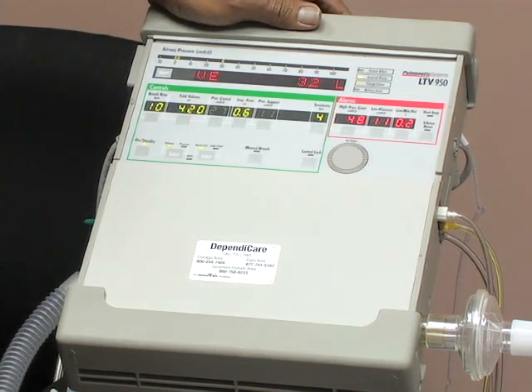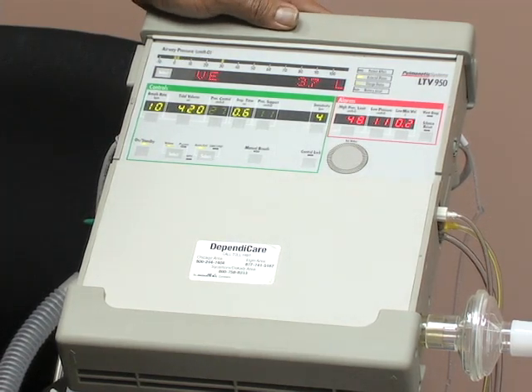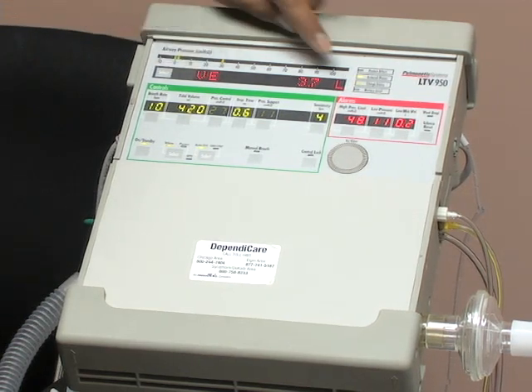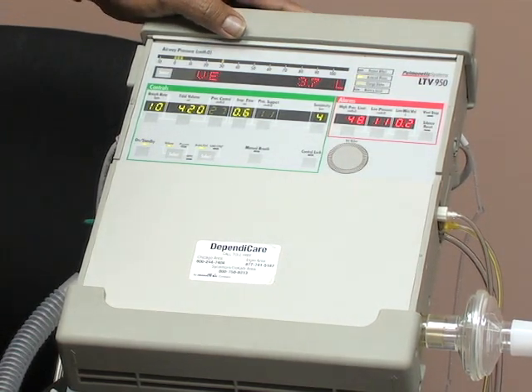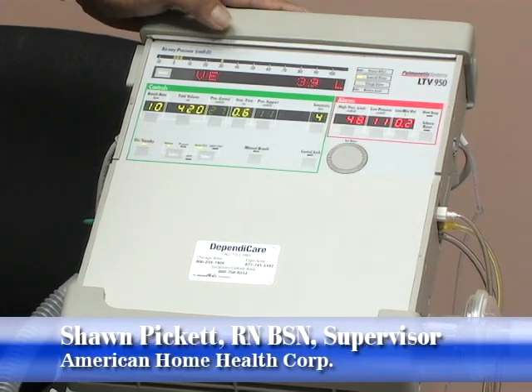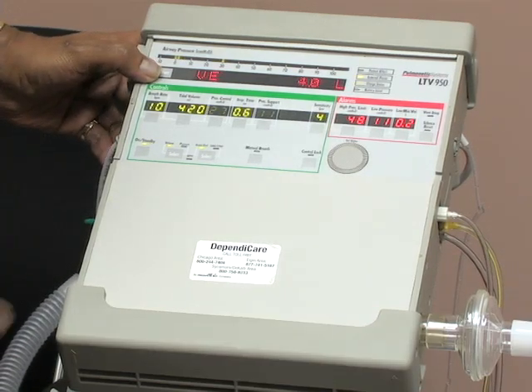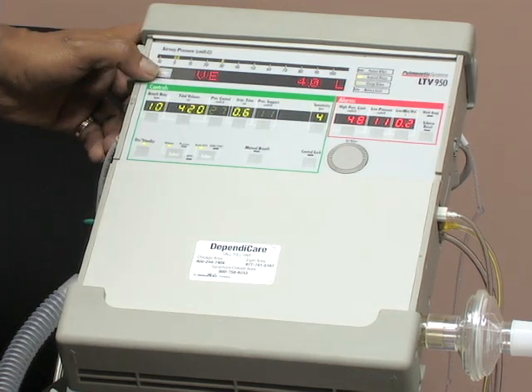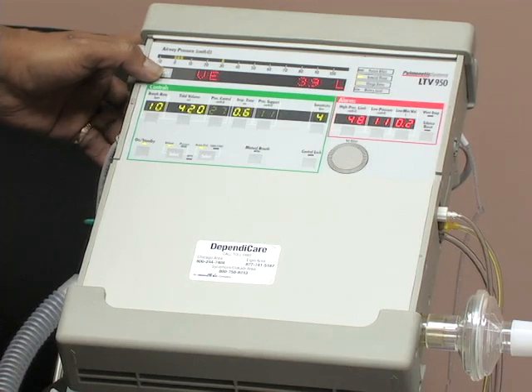Let's look at your VE. This is your minute volume. It's also an expiratory volume, but your VE is a measurement in liters versus milliliters of how much your client has expired over the last 60 seconds. And this value is also something that's more of a long-term indication and is more useful to our pulmonologists and respiratory therapists when they decide to make some changes.